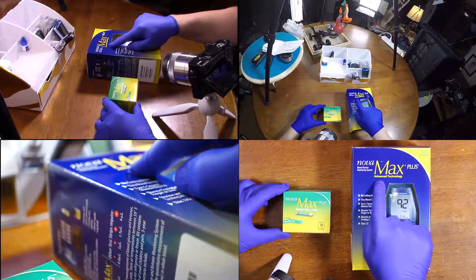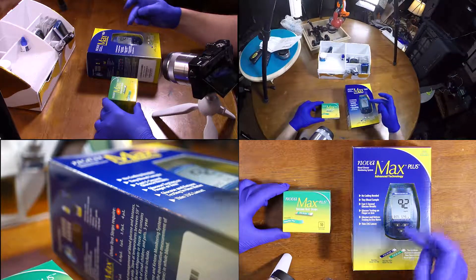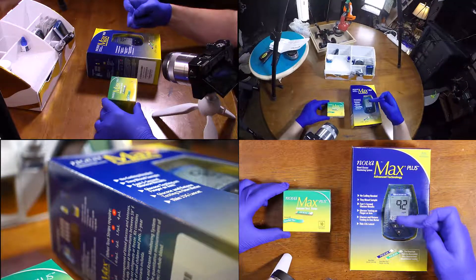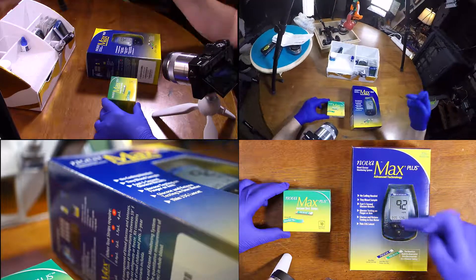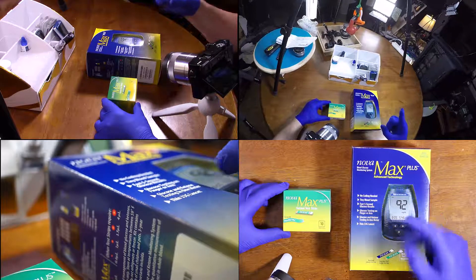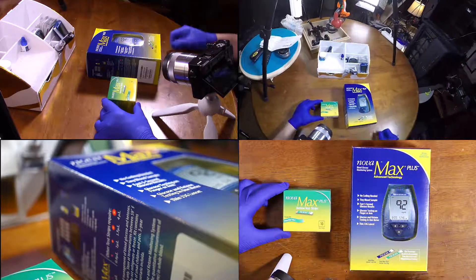Nova Max Advanced Technology Plus blood glucose monitoring system. It's got no coding needed, tiny blood sample, fast five-second glucose results, glucose testing on finger or arm, glucose and ketone testing in one meter, and thin 33-gauge lancets.